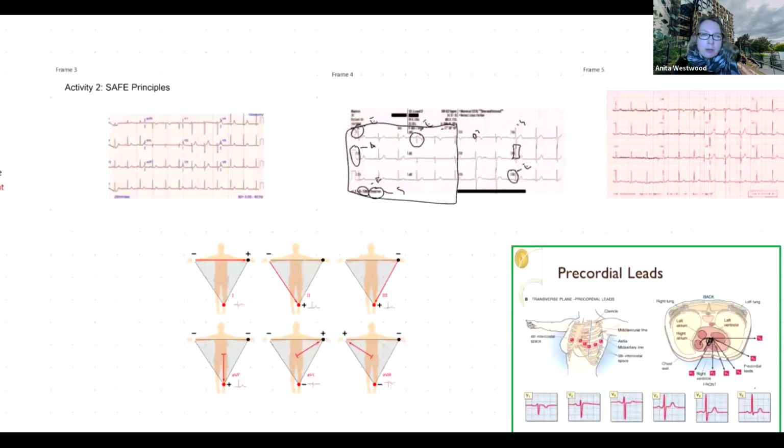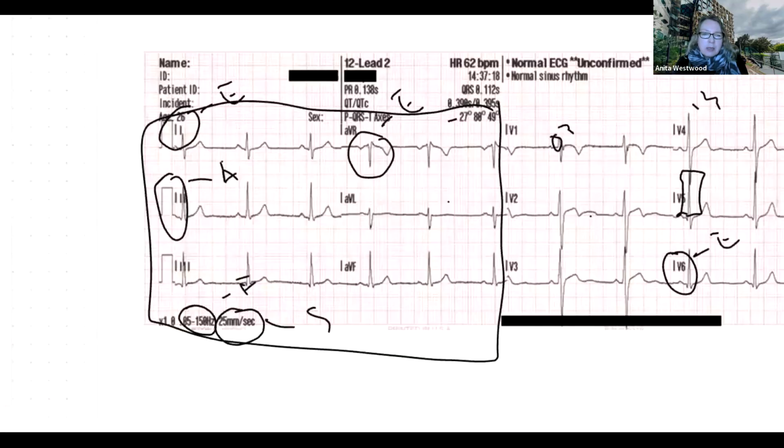And all we know that we're looking at electrically here is depolarization and repolarization as a summation moving down towards limb lead 2. And if there's an error in there, if there's a coronary artery occlusion, if there's some problem with depolarization and repolarization, we would detect it best with the lead that's looking directly at it, which is why if you've got a septal lead, for instance, and we're looking at V1, V2, we're going to be able to see that potentially from that view.